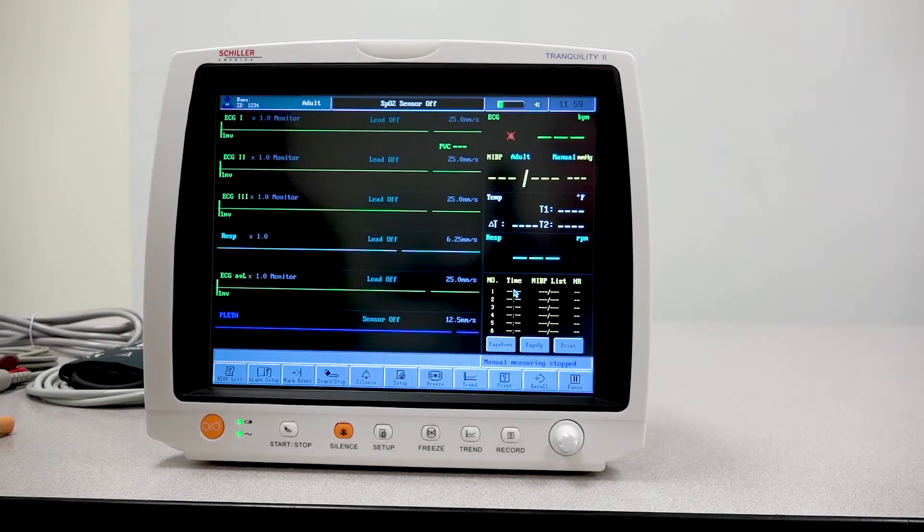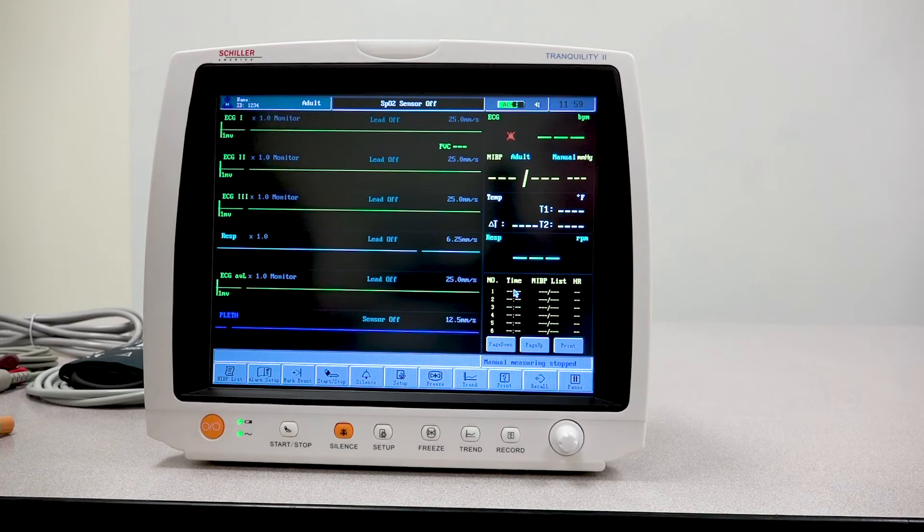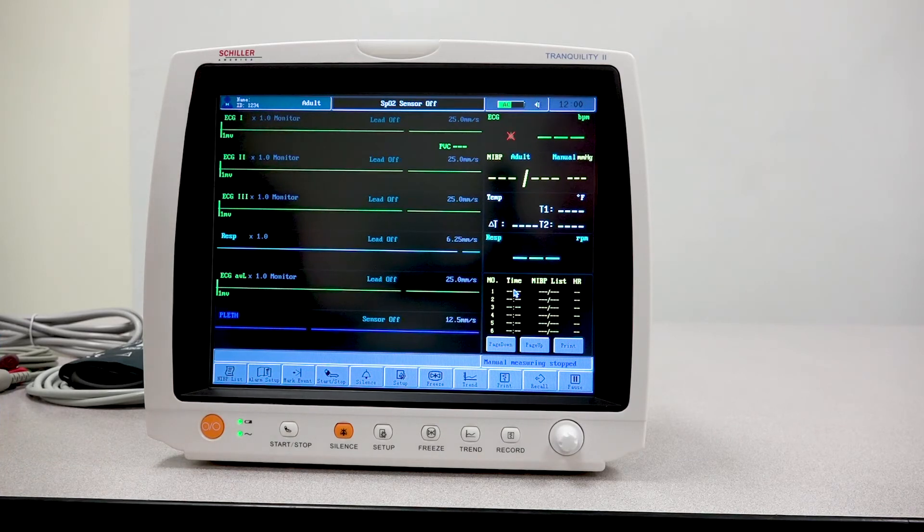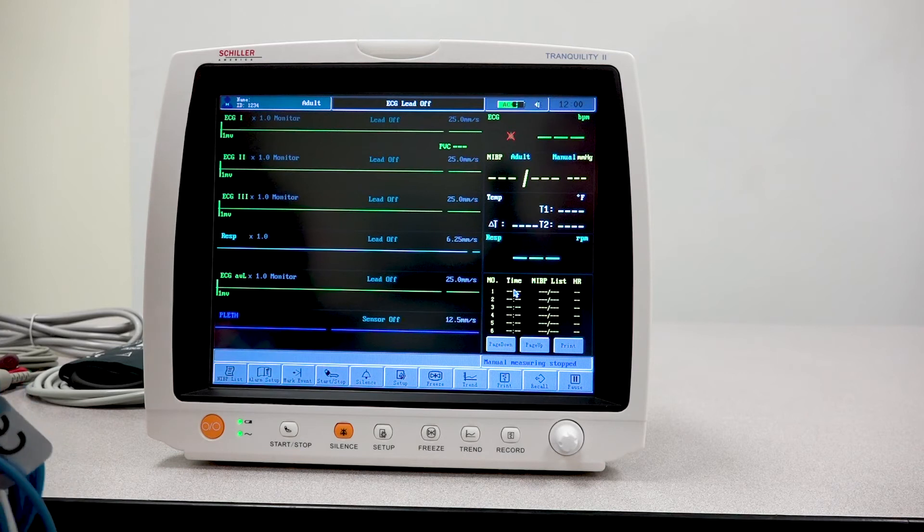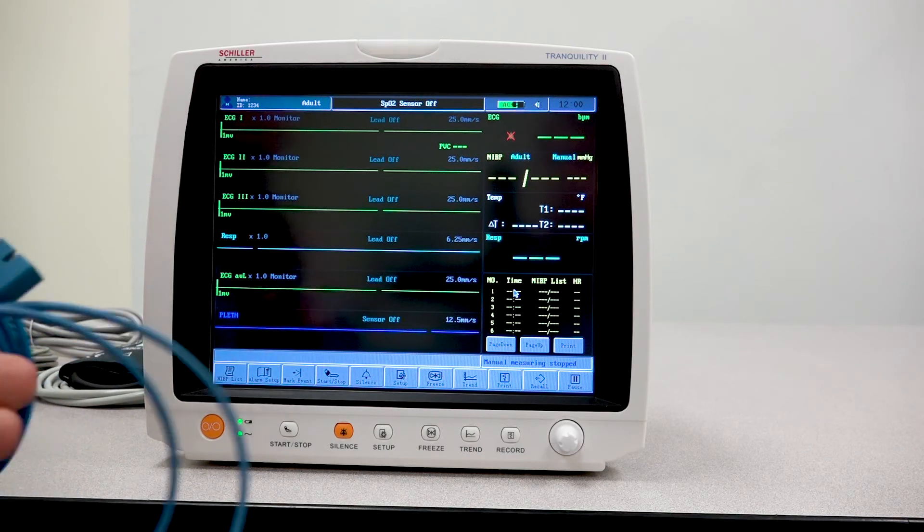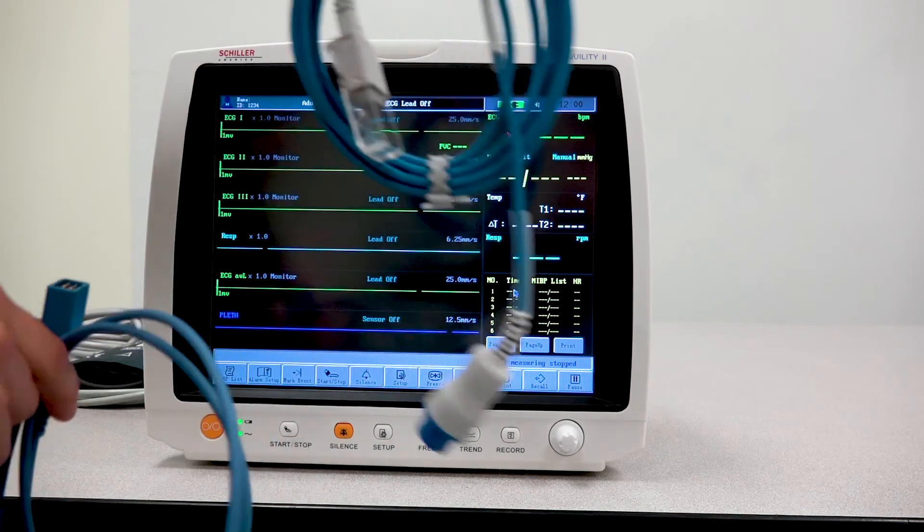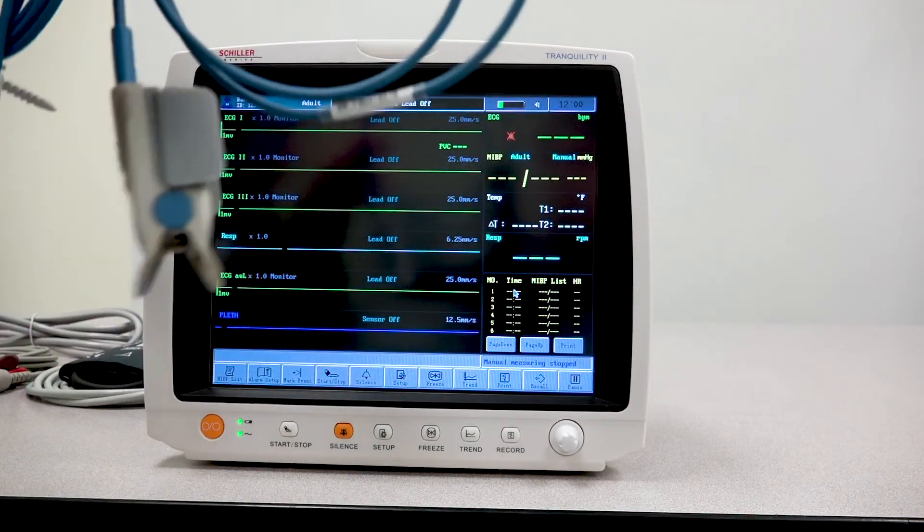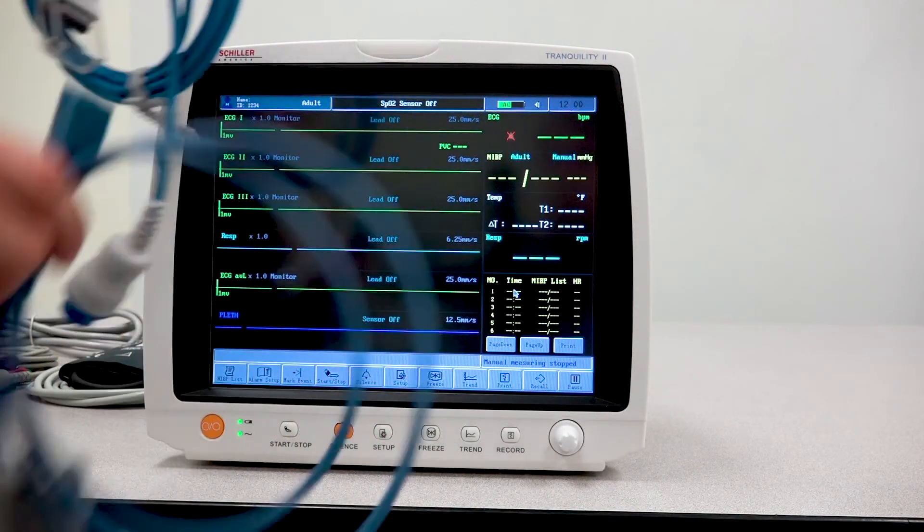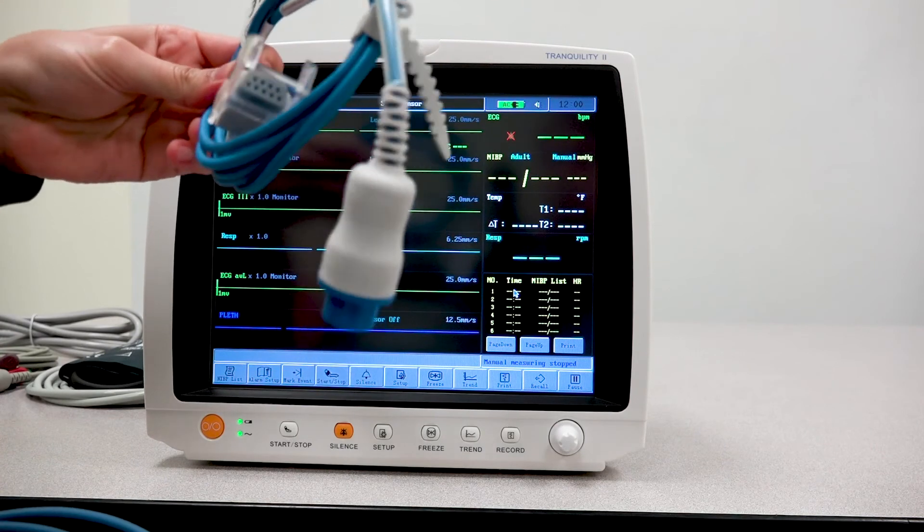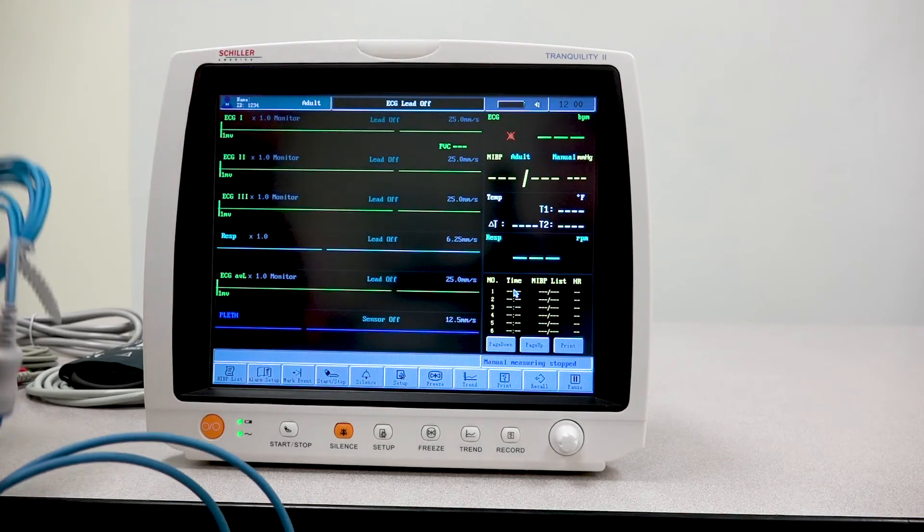If I was hooking up a patient, I would have all my accessories ready to go. Now, I want to point out a few things when it comes to the accessories. For example, this SPO2 sensor will come in two parts: your actual finger sensor and the extension cable that actually connects the monitor.